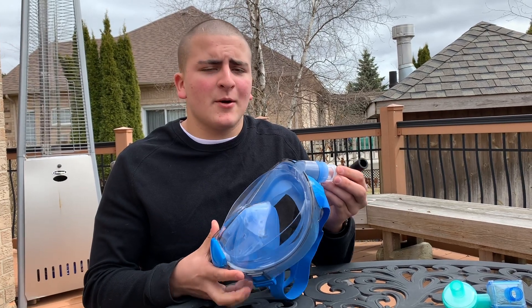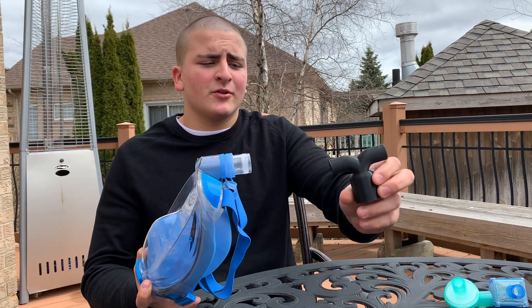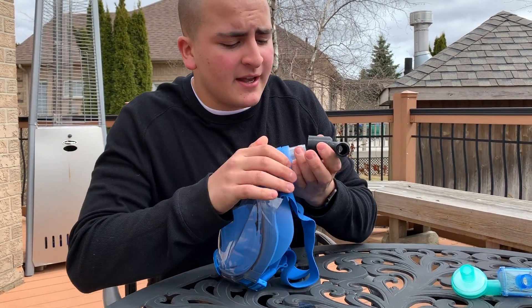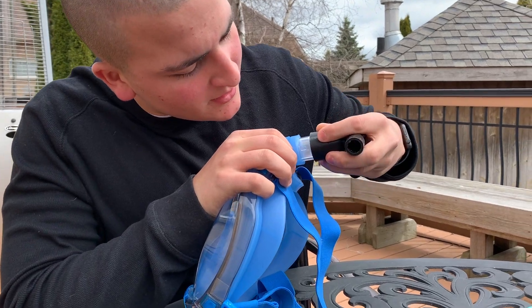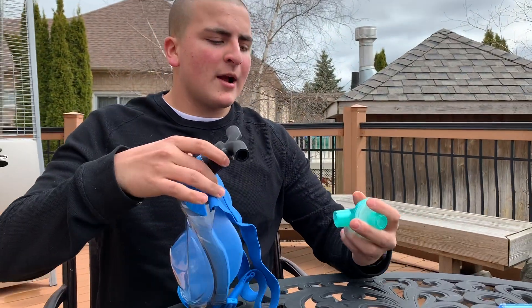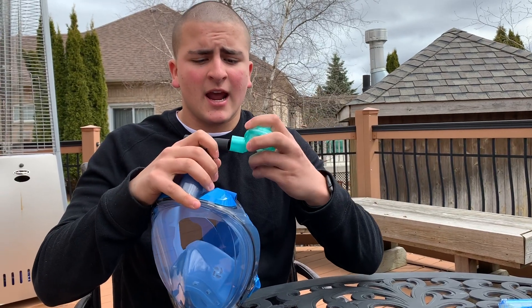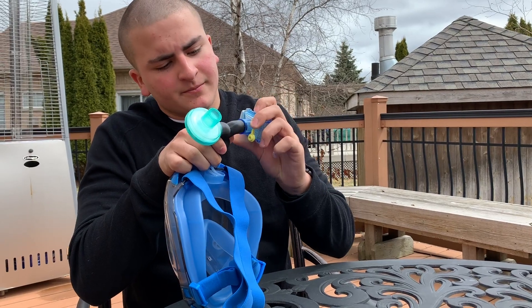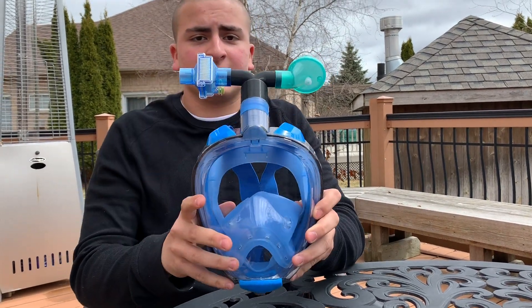Now we're going to talk about how we can actually assemble this mask. You're going to take your T-shaped 3D printed adapter and attach it to the mask — it has a locking mechanism, so all you do is push it in and lock. Then you grab your anesthesia filters and put them on each side. And that's all it is. In terms of actually fitting the mask, we recommend that you bring it to your employee health and get it fitted as you would any N95 mask.